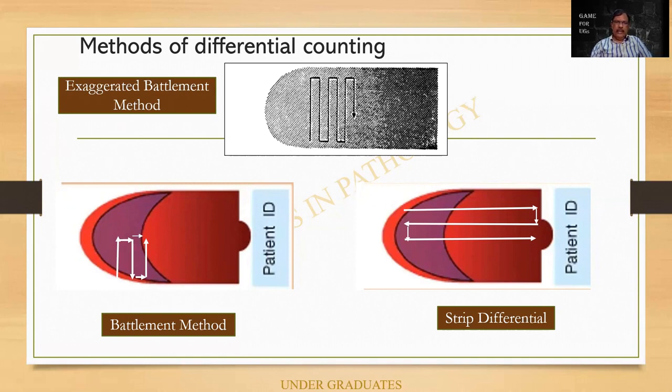Please do not answer zigzag method in the exam. That is a very colloquial one. You people should be able to explain, even if the examiner asks, what is the battlement method? You people should be able to explain.